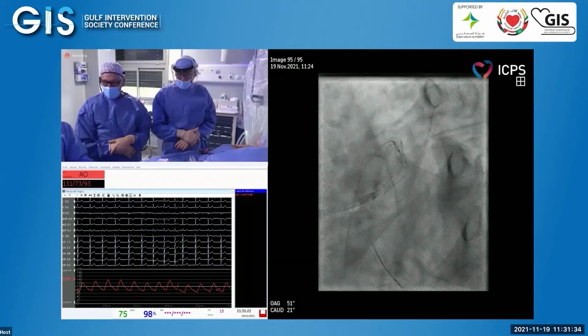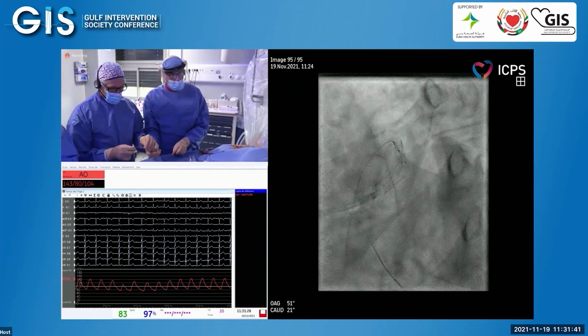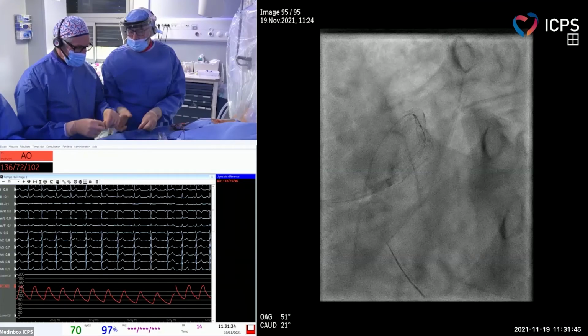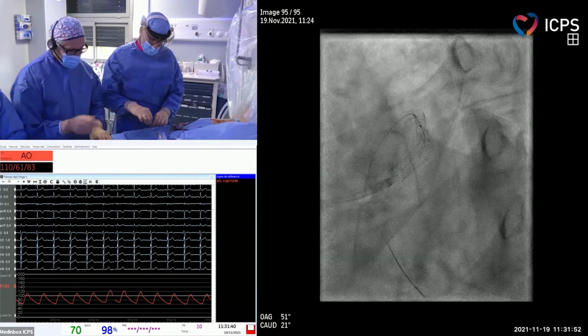It will be interesting to see the expansion of the stent in that ostial LAD, where you did the most of the shockwave pulses. Yeah, absolutely. So after the kiss, we'll do OFDI to show you that.